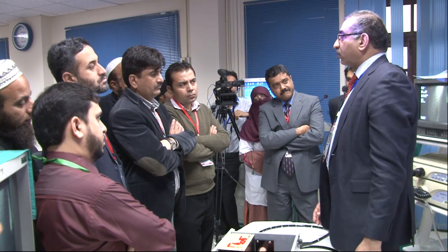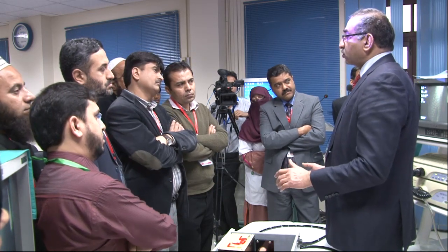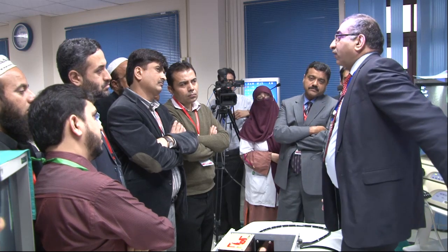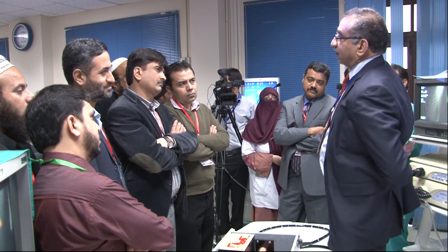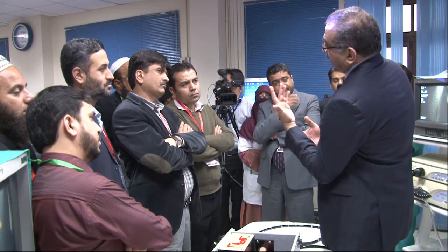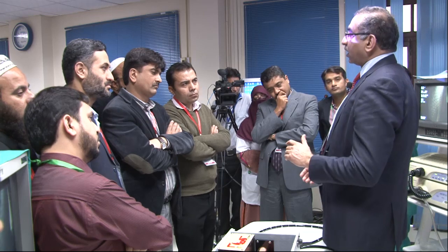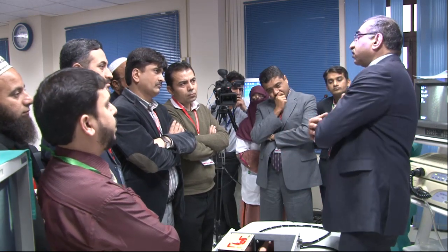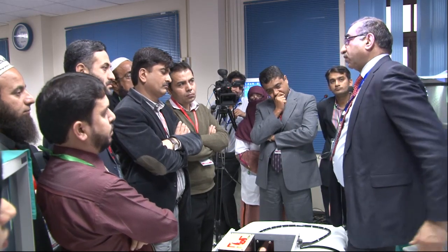I tend to just leave them the way they are because it doesn't really matter, but some people prefer to do it. Generally, the arm should be out of the way and it should be behind. Whenever we ask the patient, I always tell them, as if you are being arrested. So, the arm behind them. When they are lying on their face, with an OGD, you just lie them like that. But if you do that, you can't lie them totally prone if you need to. And secondly, the arm will get in the way of your screening. Your humerus or radius will come in the way. So to avoid that, you put them in that position.